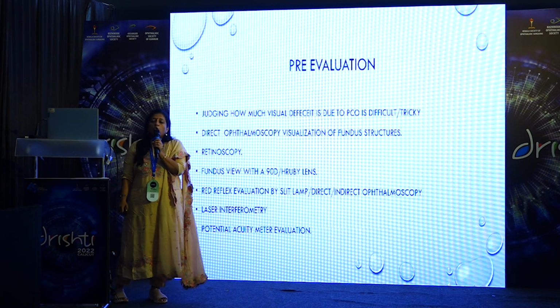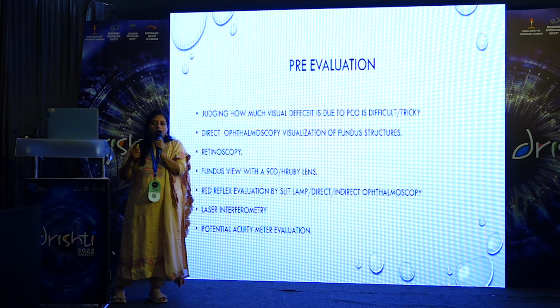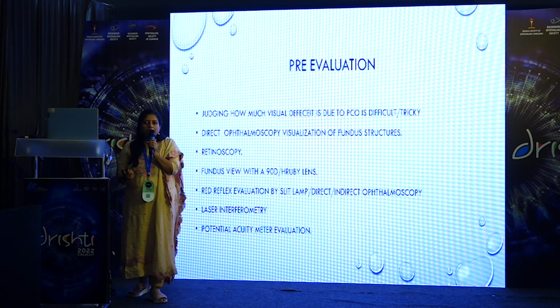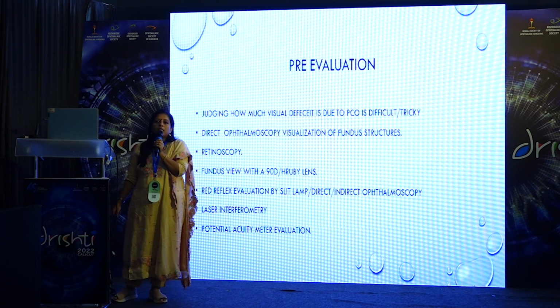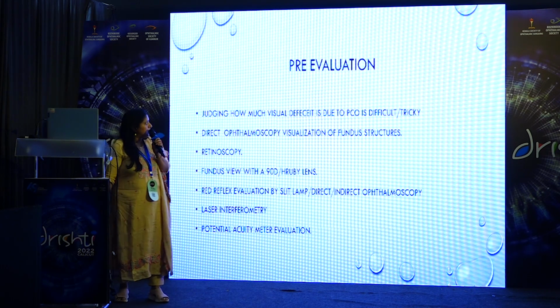In the pre-evaluation, what we basically do is we assess how thick is the opacity and whether the capsulotomy is absolutely needed. This can be done mainly by how far we are able to make out the retinal findings on a fundus evaluation. You can look at the fundus with a 90D lens, then red reflex evaluation, all can be done.